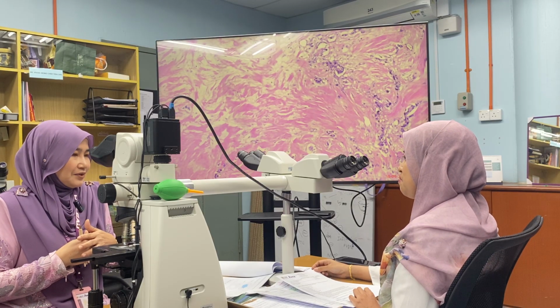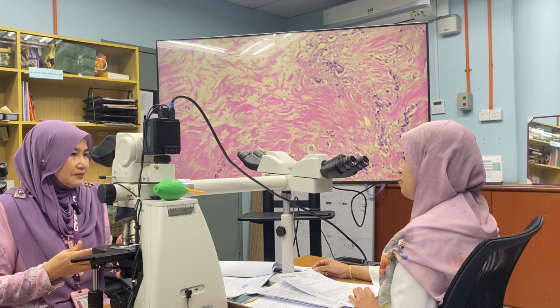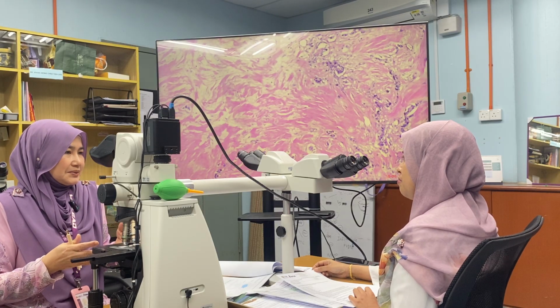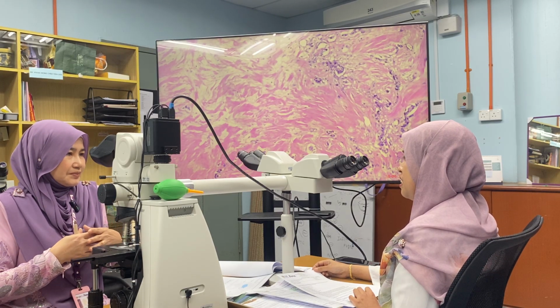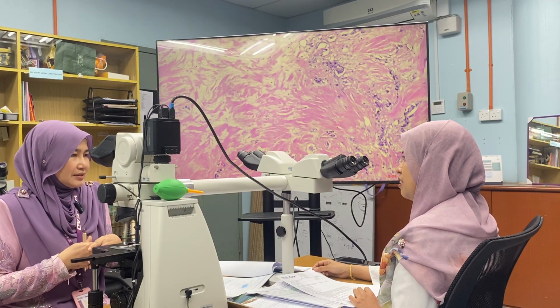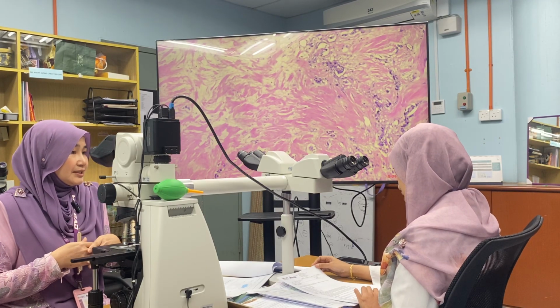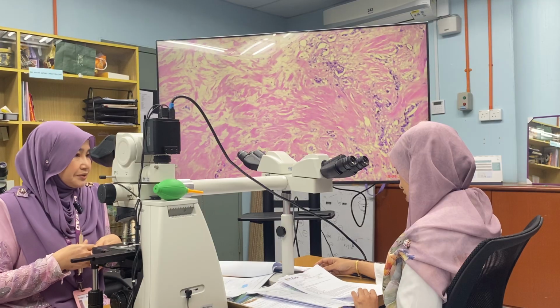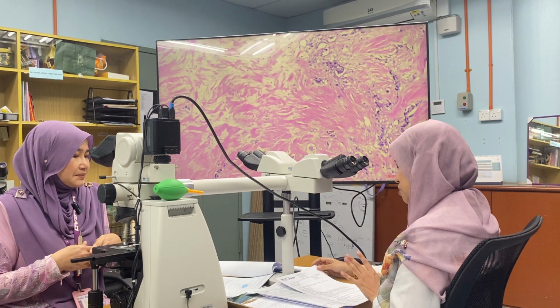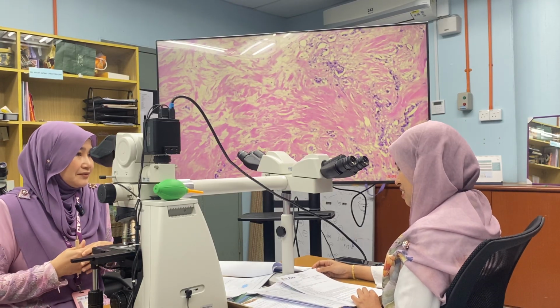And then for the lymph nodes, apart from counting how many lymph nodes are involved, what else do you need to examine? Whether there's any capsular invasion. Capsular invasion, or we call it extranodal extension. Okay. So do you report that? Is there any extranodal extension in our case? No, there's no capsular invasion, but there is a tumor deposit. Tumor deposit, yes, meaning that it is outside of the lymph node.